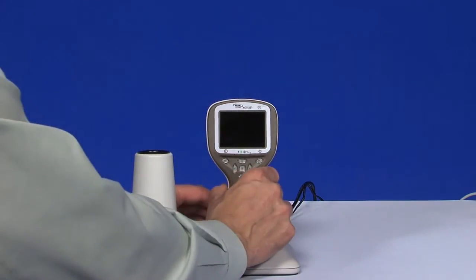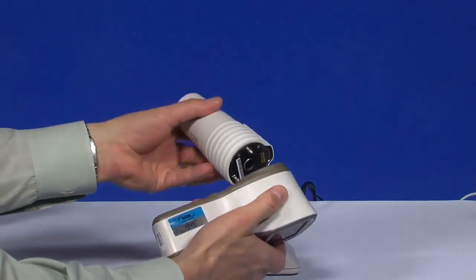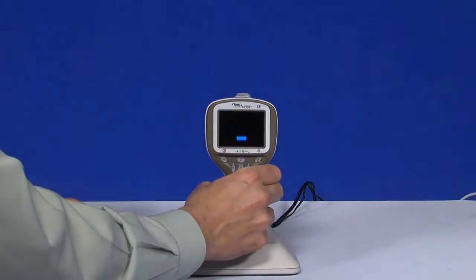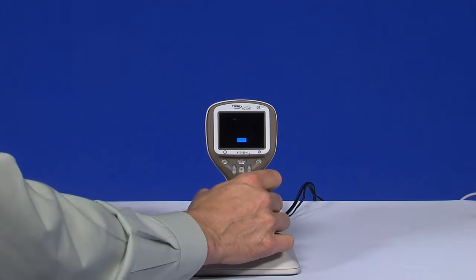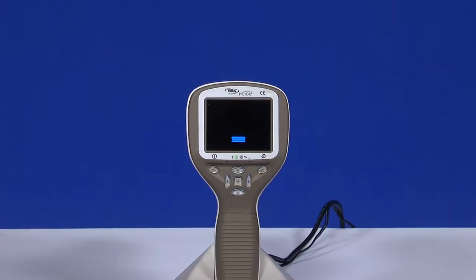Let's go through the steps for using Pictor with the retinal attachment. Attach the retinal module to the Pictor camera. The examination room should be as dark as possible. Both the patient and the examiner should be seated while taking the images.